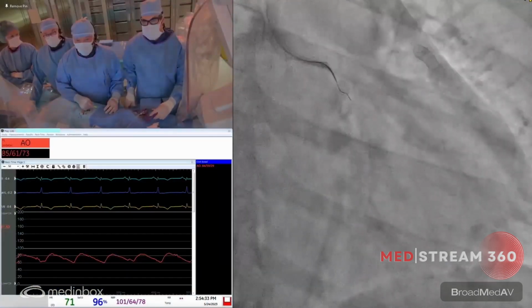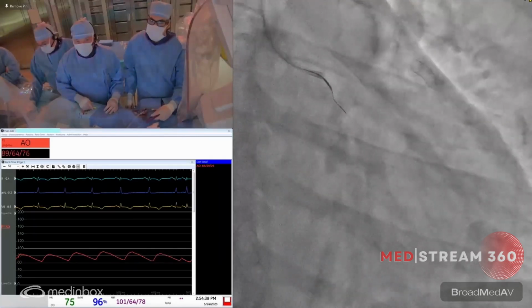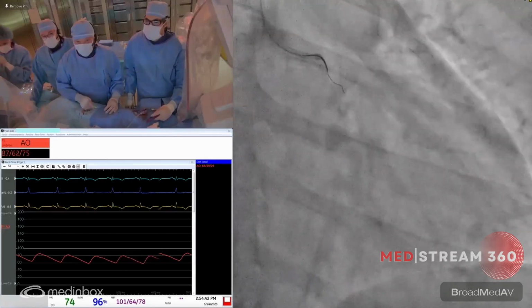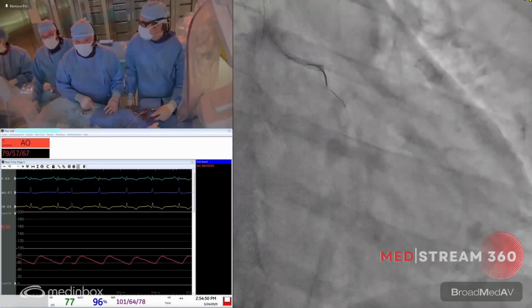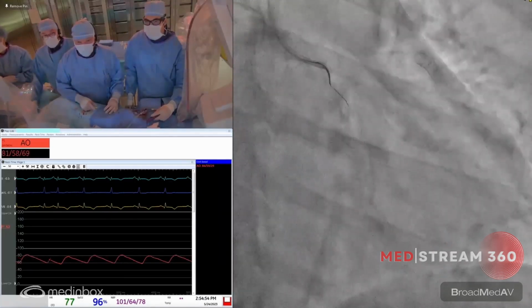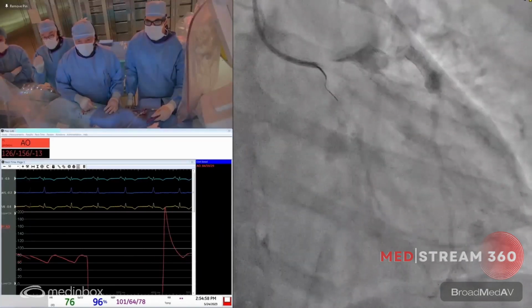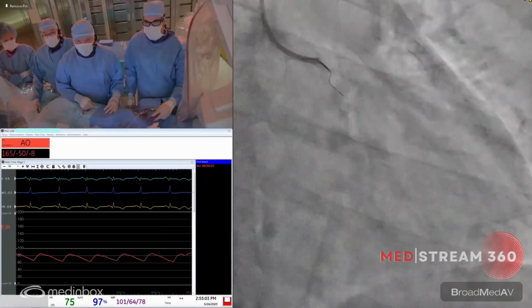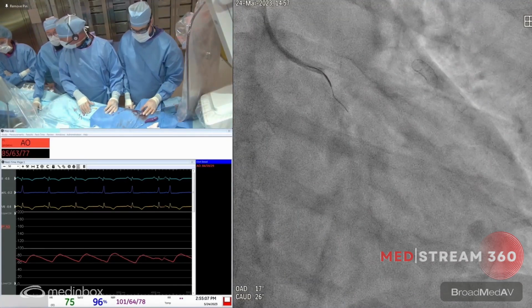So what are the next steps? Keep with the microcatheter and switch for another option of wire. If I'm convinced that I'm in the right direction, I will use a stiffer wire, but I would check probably in two angles to make sure. But it looks really promising. Control your wire, and you were in the small branch, so I'm sure you're probably in the microchannel. And you want to look at the spider view? But just take one shot, maybe just to see.